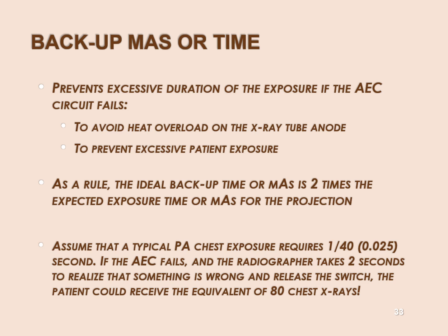And if nothing's reaching the ion chamber, nothing's reaching the image receptor either. And so you don't have an image and you just dosed your patient for nothing. Okay, so you can get in trouble with AEC if you don't have adequate kilovoltage. Okay, the backup timer is saving you from ridiculously overexposing your patient and overheating your X-ray tube.